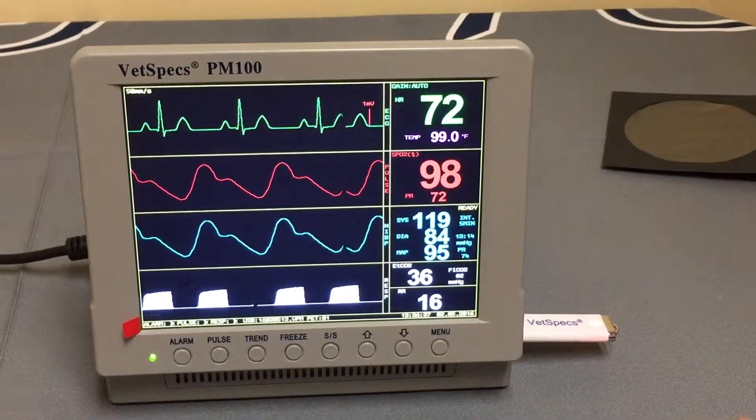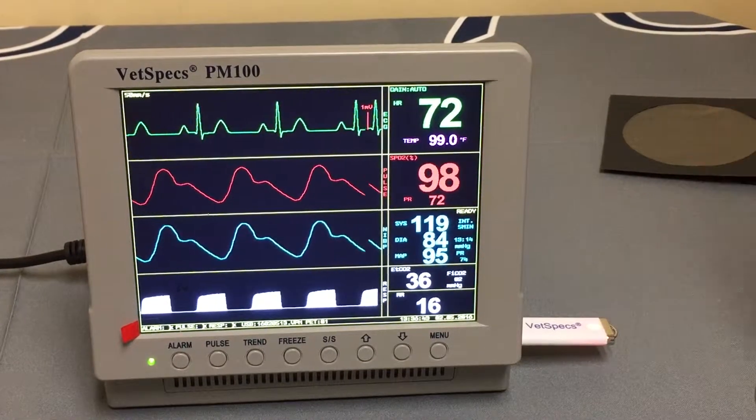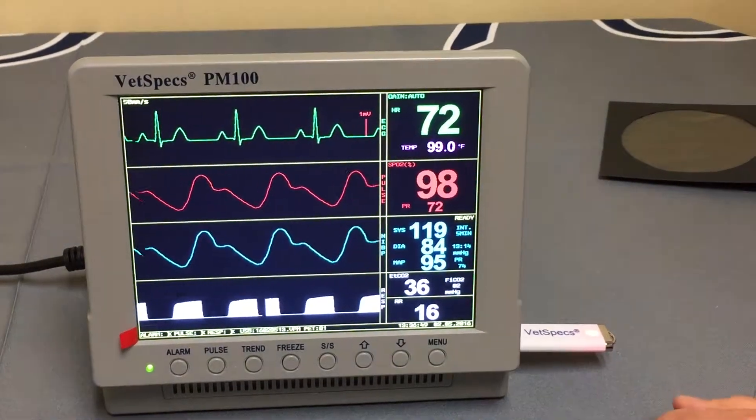With all of that in mind, the workflow is very simple: turn the monitor on, hook your patient up, plug your flash drive in, and allow the monitor to do its thing. At the end of surgery, power the unit off and remove your flash drive.